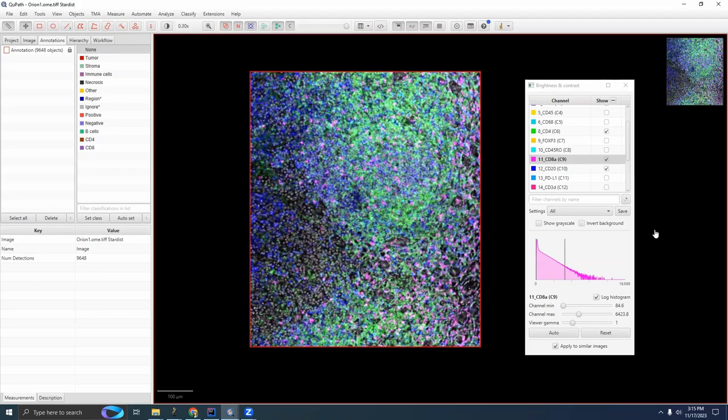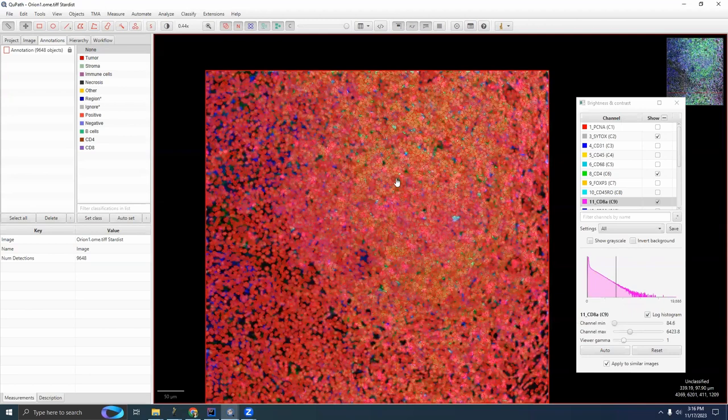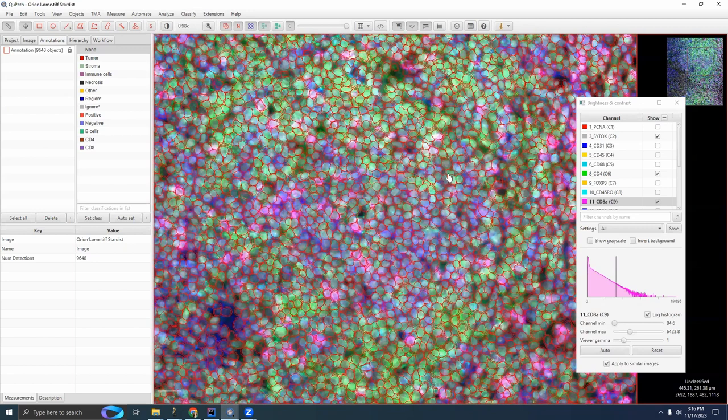All right. Here's an example of the type of thing you can do with scripting that you actually can't do with the standard user interface. What I have here is a small crop of the large Orion tonsil dataset. This image has 20 channels, but for now what we're looking at is B cells in blue, CD4 cells in green, and CD8 cells in pink. And what I want to do is classify those three types of cells. And so I've already performed a segmentation via StarDist. And you can see real quick that it does a pretty good job, though tonsil is so dense that it's almost impossible to get the segmentation exactly right.